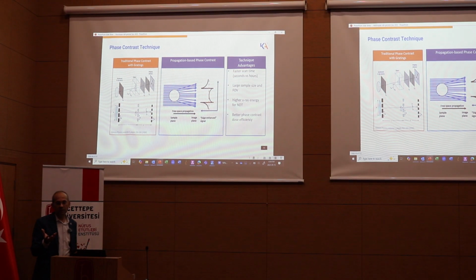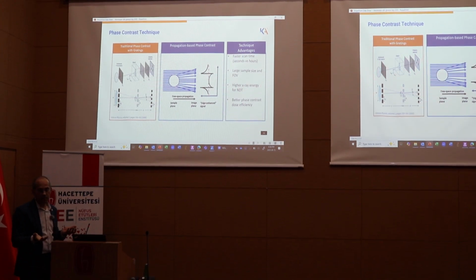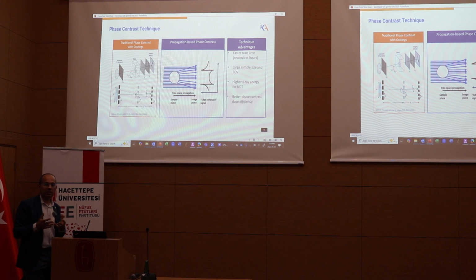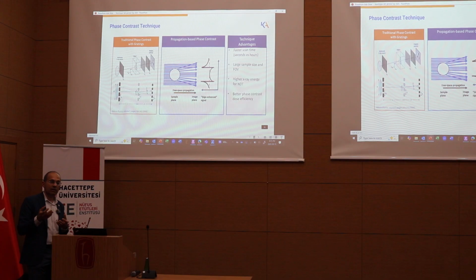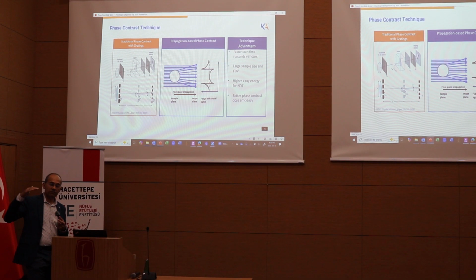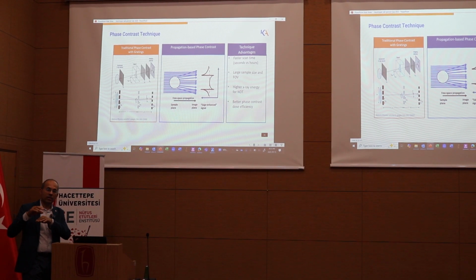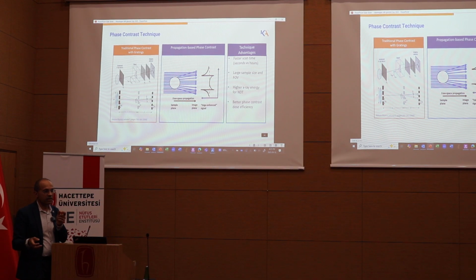And there are many ways to get this type of phase. You can use gratings, which is typically what you do in high school. We would play around with diffraction gratings to see what was going on. With us, we do it using two ways. You can use a grating, but an X-ray grating is not so easy to make. You can also use propagation. So if there's a phase change and you create some distance between the detector, the wave is allowed to propagate. That phase change can result in some nice interference patterns that you can pick up. The phase change is very small. It's like in microradians.